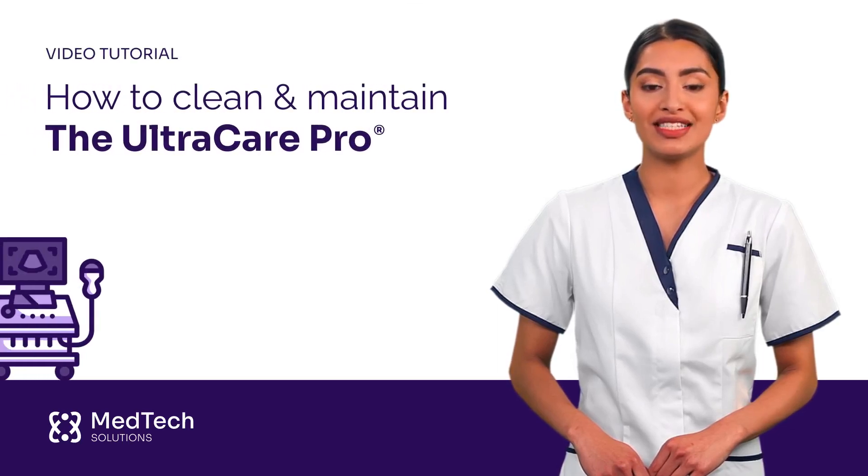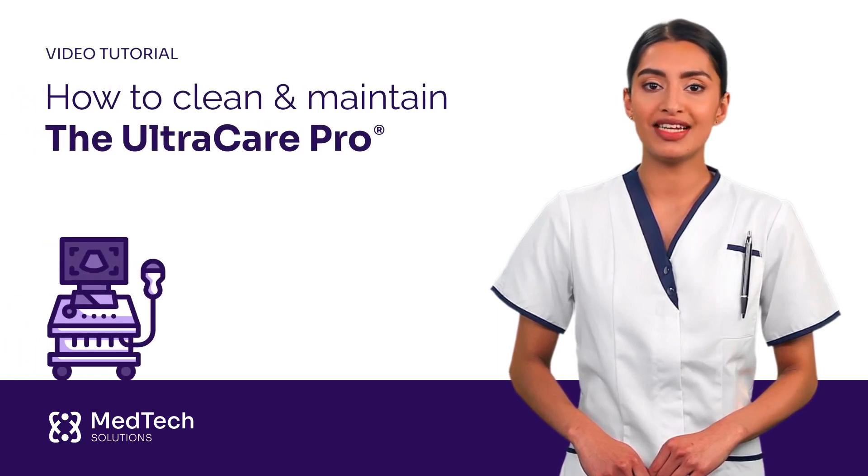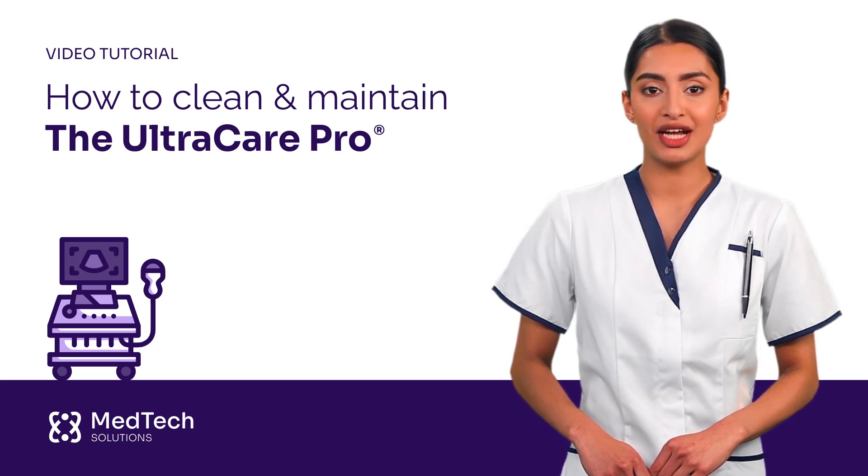Maintaining medical equipment not only extends its life but also ensures the safety and effectiveness of the scans. Today we're addressing the proper maintenance and cleaning of our premier ultrasound machine, the UltraCare Pro.